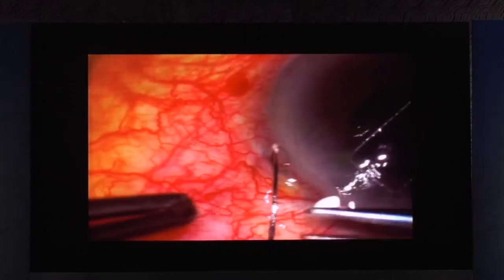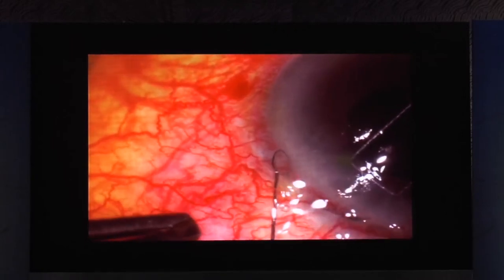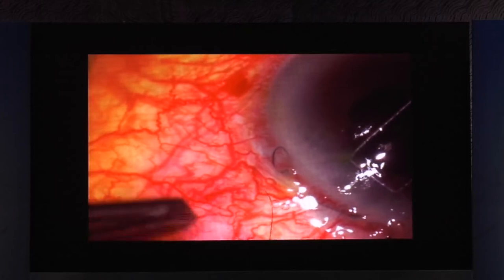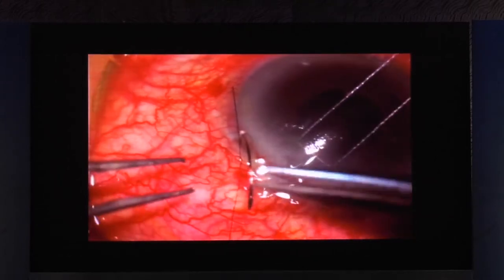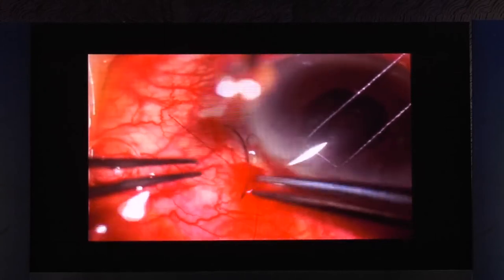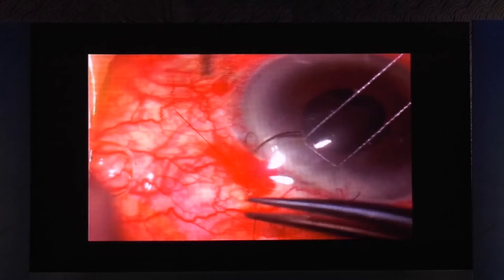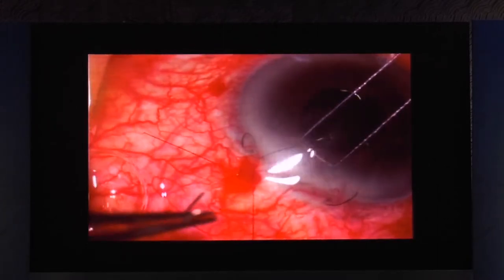So with a buttonhole, what you must be very careful about is that these conjunctivas tend to be very thin. Any tugging of the conjunctiva, it can be scarred and very thin. So any pulling or any counter-traction can lead to more buttonhole formation as you try to repair the primary buttonhole. So be very careful. You can see there's a leak there. So what he has done is he doesn't use any counter-traction, uses a round body needle, a 10-0 nylon suture, and he does a cross suture across the area of the buttonhole.